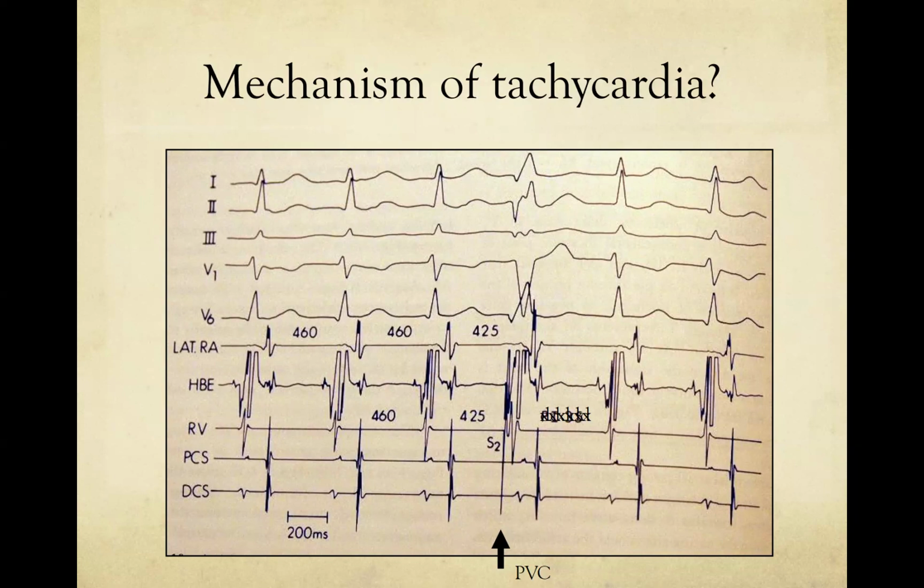Sorry. I think given that the rate's on the slower end, it's less likely to be an AVNRT type. Okay, actually, AVNRT in general is the slower one on average, not a guarantee at all, but in general, when people have AVNRT, the rhythm is usually a little slower. So in kids, I'd say most of the time, at least when we're under anesthesia, a typical AVNRT might be 180 as opposed to ORT, which might be 200.